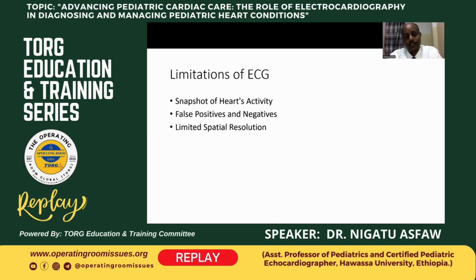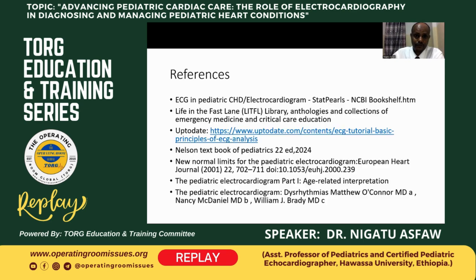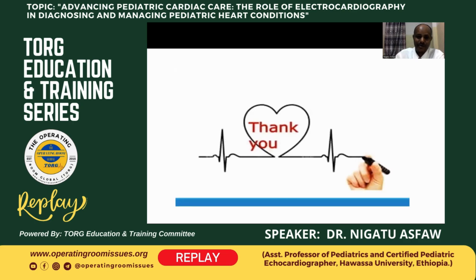And as I said, we view the heart only from certain angles, so there is limited spatial resolution, and ECG may not differentiate between hypertrophy and dilatation. And these are my references, and thank you so much.